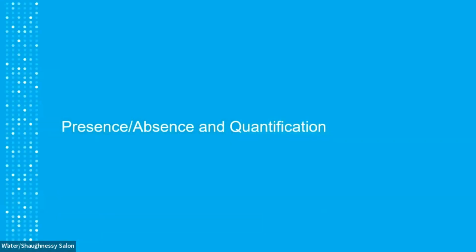So that's basically the simple way of looking at the science of how these enzymatic tests work. Now, moving on, these tests can be run both as a presence-absence test and as a quantification method. So it's either a yes, no, or a number. And I know depending on where you're located, you might be able to do one or the other. The important part is that it's the same products, the only difference is in how you process that sample.